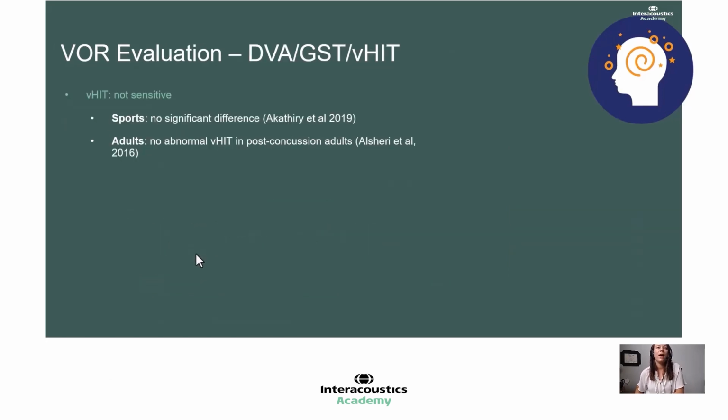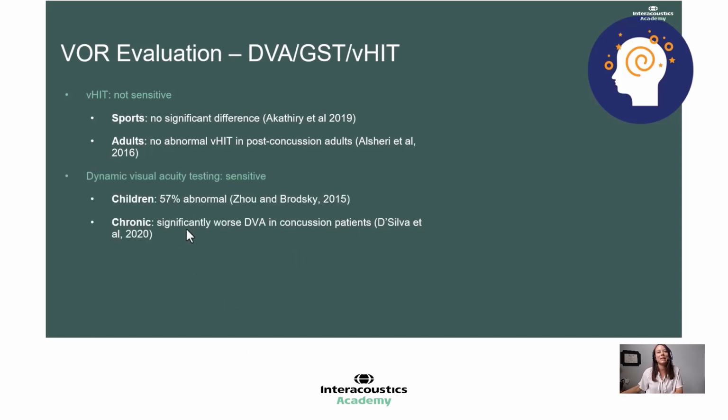Ultimately, with video head impulse testing, we found that most research does not find it to be a sensitive tool post-concussion, which is surprising because most concussion patients will complain of dizziness when their head is in motion. So you'd expect that VHIT may be a tool that is abnormal, but research has not indicated that.